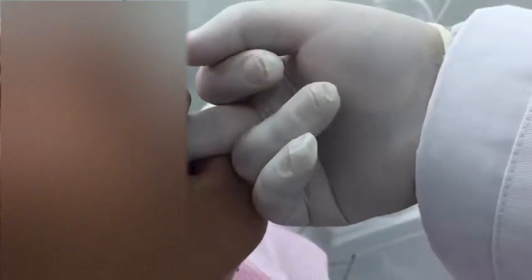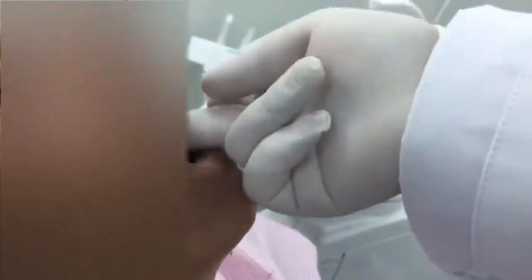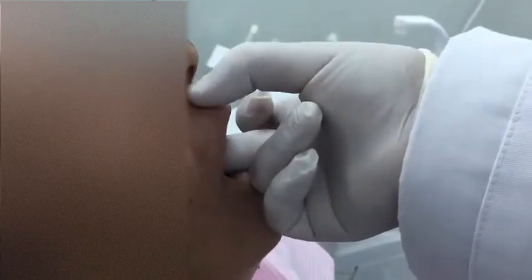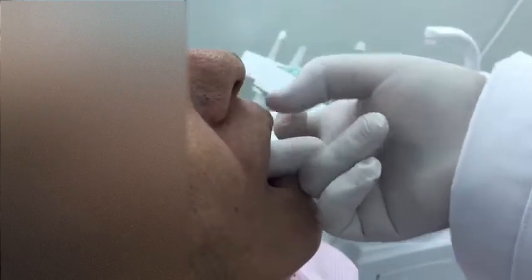We're talking today about labial fullness. The student was asking where the bulge is coming from — the acrylic. I would say yes: if you come and put the base plates inside, you find that the bulge immediately is beneath the nose, so your diagnosis is correct. How to diagnose acrylic bulging from wax bulging?